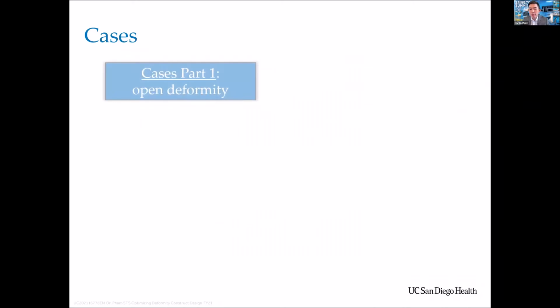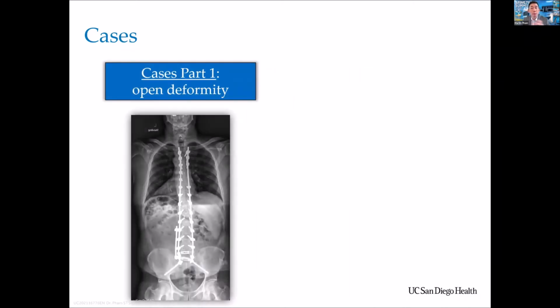In the cases section, it's split into two sections. The first part is on open deformity, so something that a lot of people are very familiar with. And for me, demonstrating how spinal robotics and the software planning can integrate into that practice.